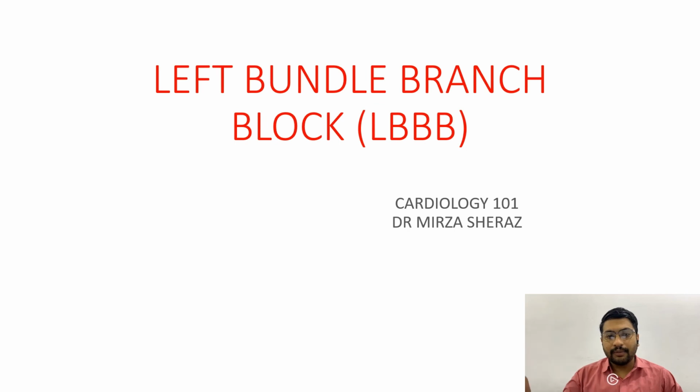Before I talk about what is left bundle branch block, I'm going to talk about why it is so important to discuss this. In many heart pathologies, this is a very common conductional block, and it also worsens the prognosis of the heart pathology. Sometimes it comes with acute myocardial infarction, for example, anterior wall MI. So with new onset left bundle branch block, it is usually coming with anterior wall MI. So it is important to learn about left bundle branch block.